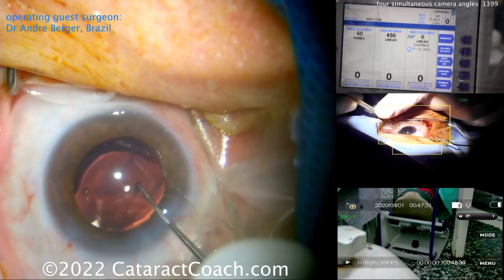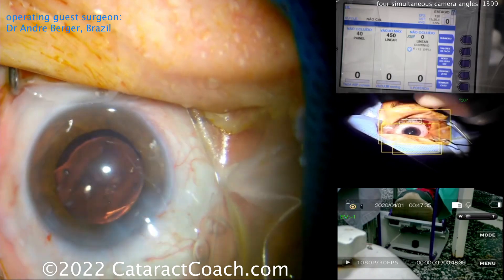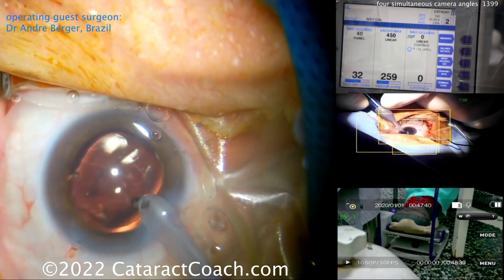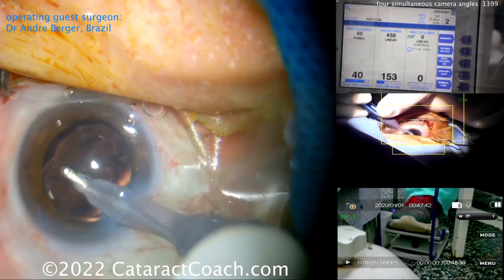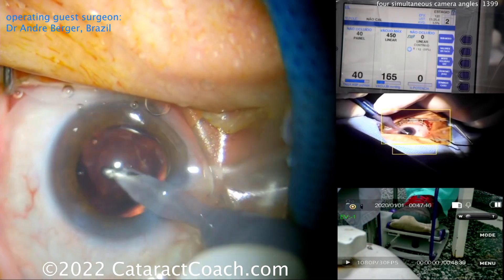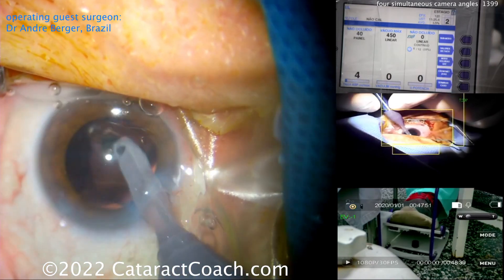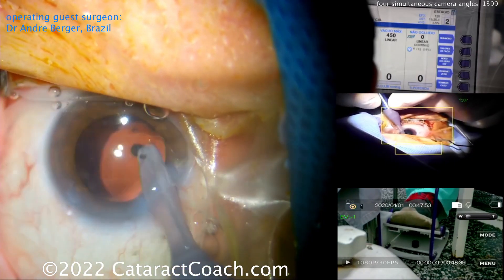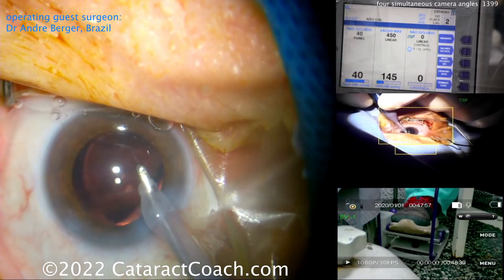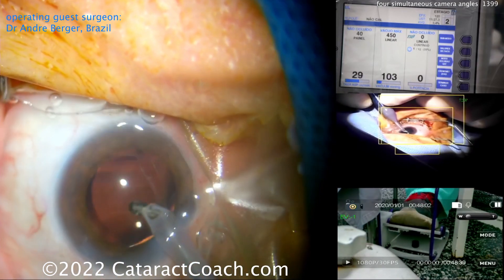He centers up the lens — that looks great. You can imagine this case is going to be over pretty soon. Nice position on that lens. Time to go into higher vacuum: 450 mmHg of vacuum and also a lot more flow — 40 cc per minute — to really wash out that viscoelastic from the eye. He's doing a good job getting that lens rotated around, making sure there's no trapped viscoelastic.